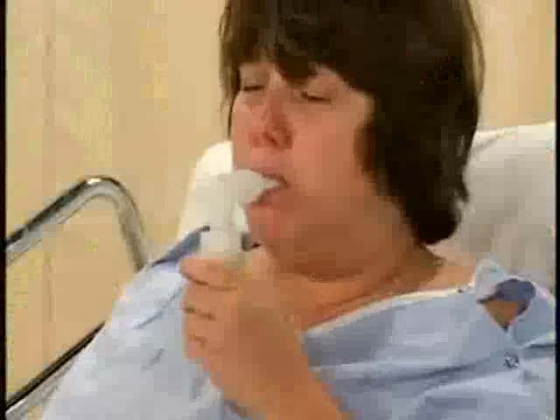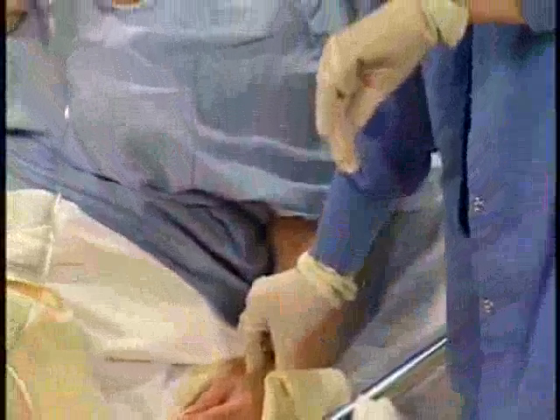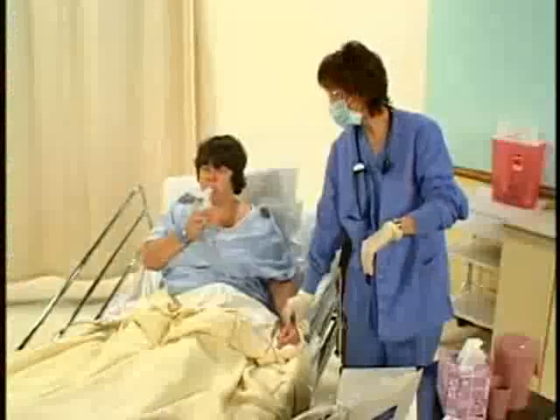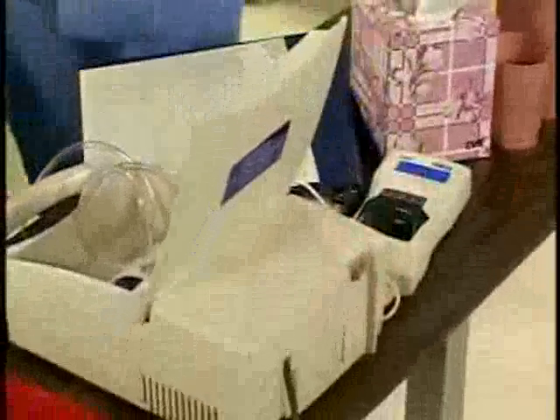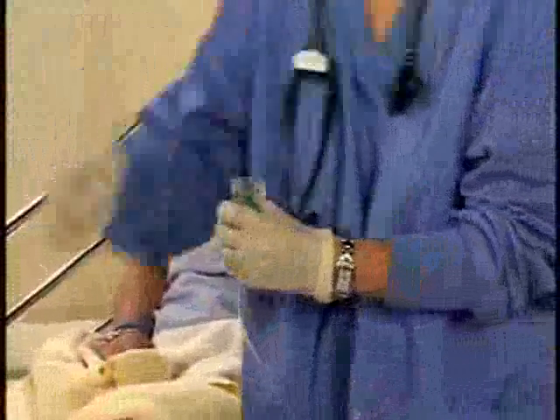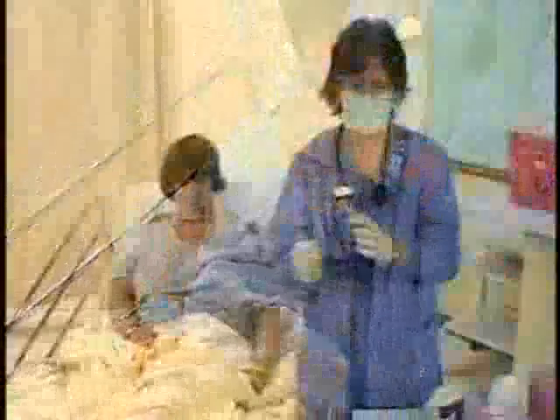Remain with the client long enough to observe the proper inhalation-exhalation technique. Also, observe the client for any side effects or distress while the medication is being administered. When the nebulizer cup is empty, turn off the compressor or wall air to stop the aerosolization. Detach the tubing from the compressor and the nebulizer cup to prepare all the components for cleaning or disposal.